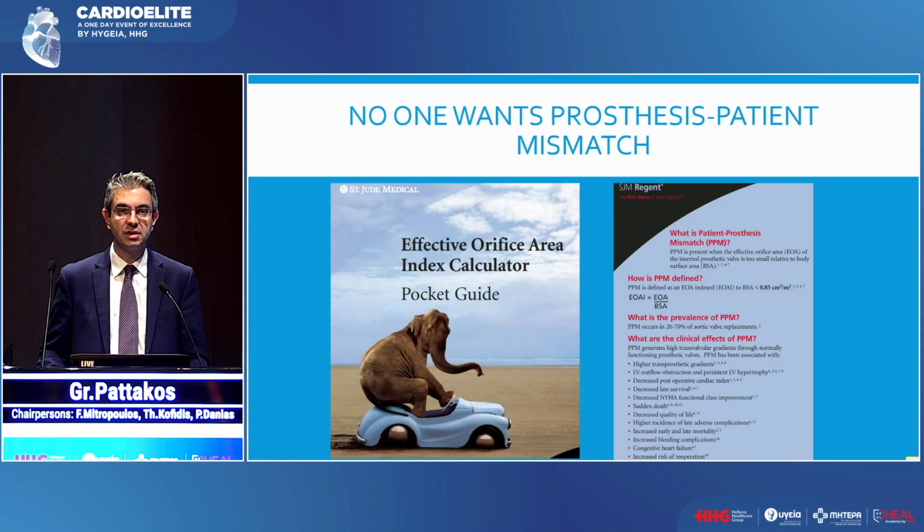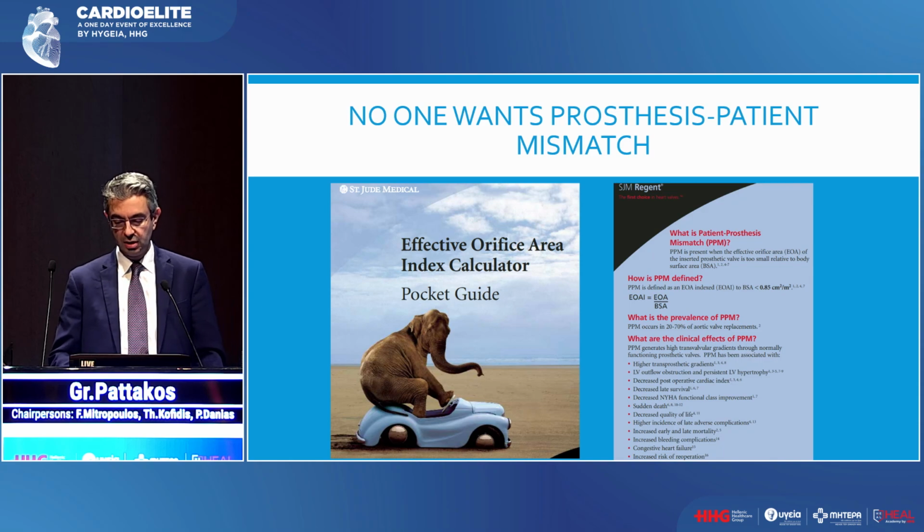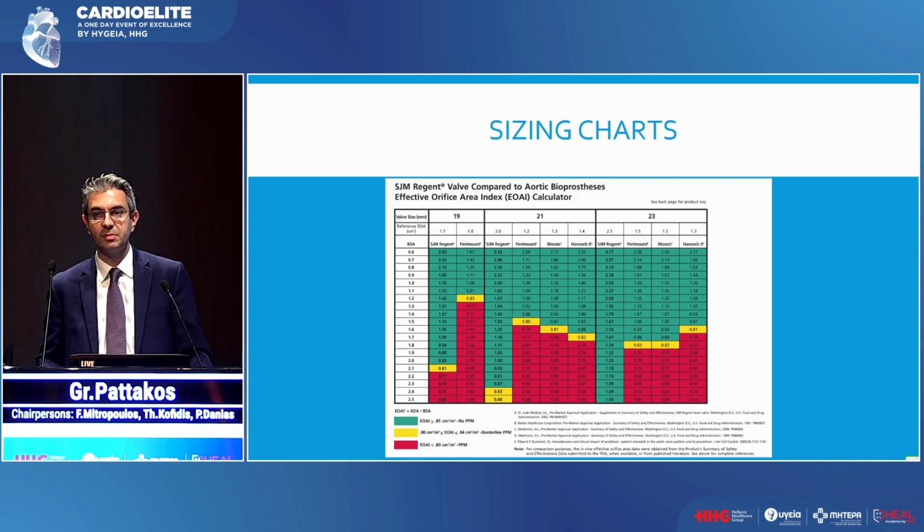So the problem with a small sized annulus is that you're going to get prosthesis-patient mismatch. And so when we look at the effective orifice area and the body surface area of the patient, we know that you need a certain size valve for a certain size patient. Otherwise, you run the risk, as noted here on this slide, of higher gradients, more likelihood of heart failure, worse quality of life, more hospital readmissions, increased risk of reoperation, increased valve degeneration. The list goes on, but there are a number of negative outcomes tied to patient prosthesis mismatch.